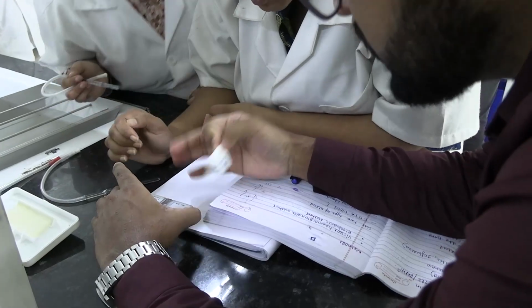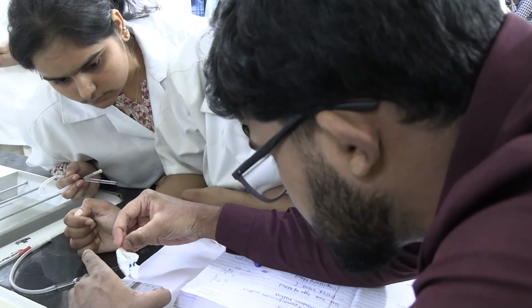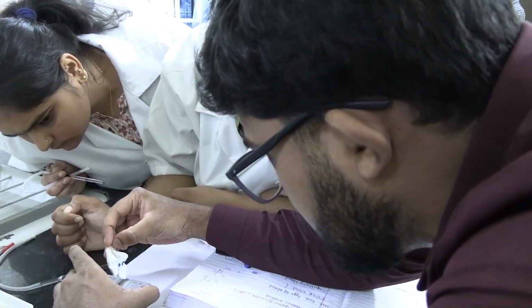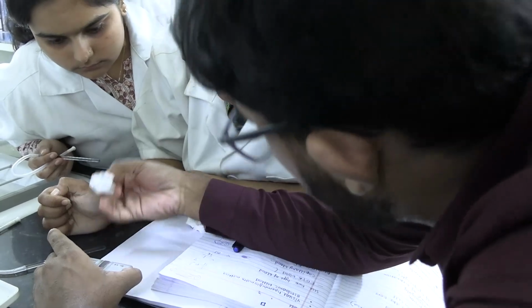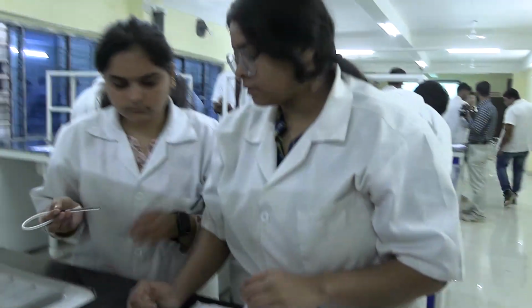Let the WBCs settle down for 5 minutes. After 5 minutes, you just touch the surface of the cover slip. Whatever extra fluid is over the cover slip will get soaked. See, it is getting soaked. Don't touch this part, because then the fluid from the chamber will come and soak into it. Now you have to keep it for 5 minutes and then we will see it on the microscope.